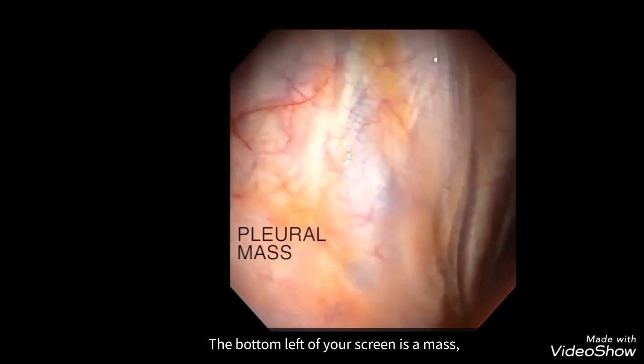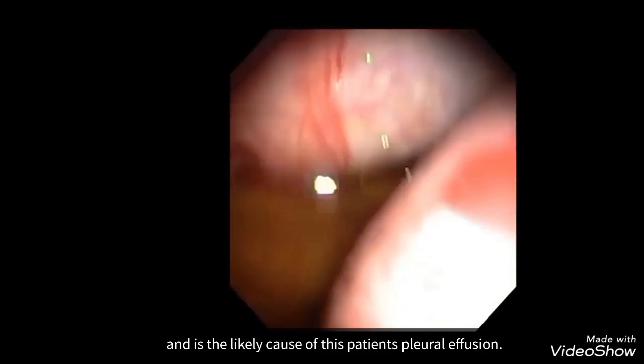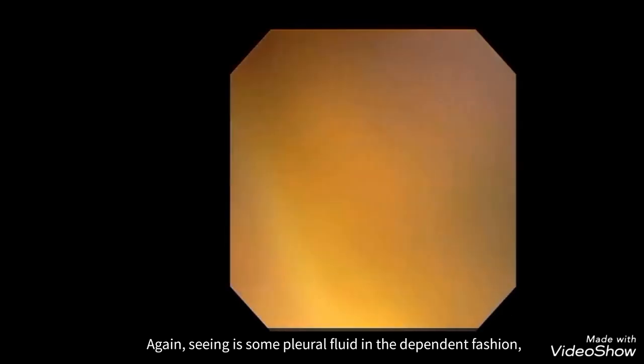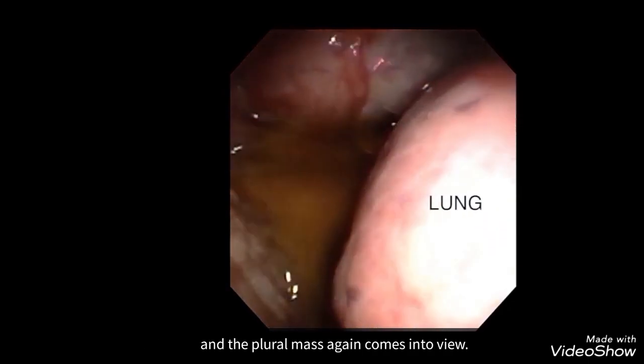At the bottom left of your screen is a mass, which is in the pleura, and is the likely cause of this patient's pleural effusion. Again, seen is some pleural fluid in the dependent fashion, and the pleural mass again comes into view.